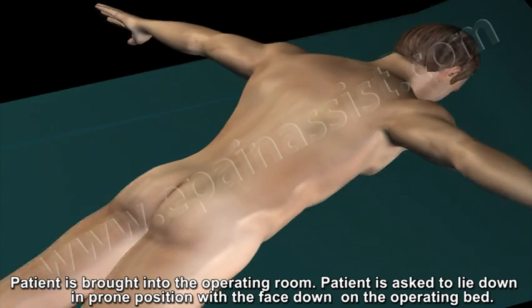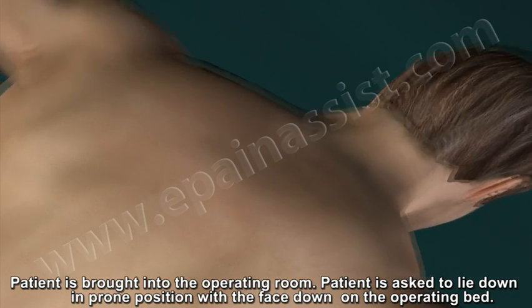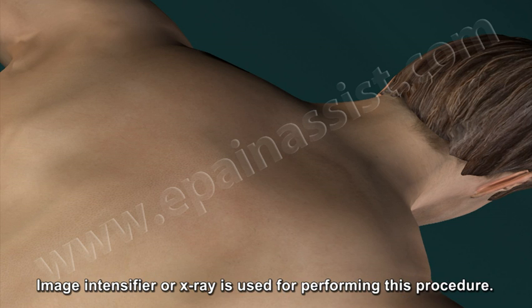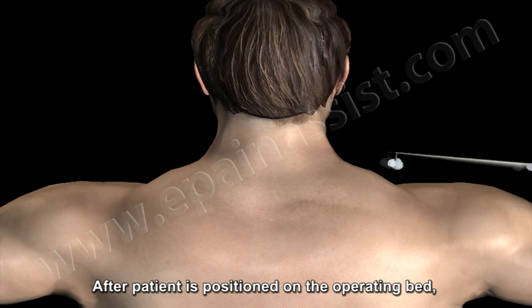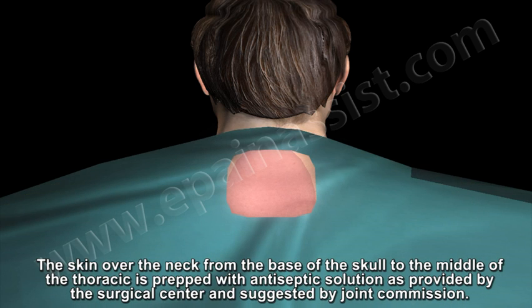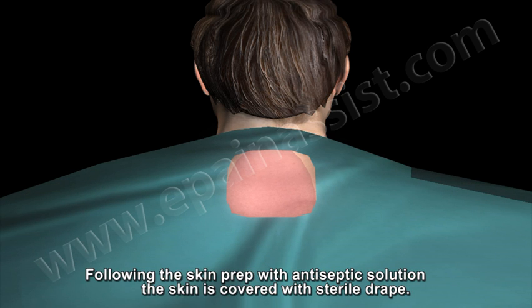Patient is brought into the operating room. Patient is asked to lie in prone position with the face down on the operating bed. Image intensifier or X-ray is used for performing this procedure. After the patient is positioned on the operating bed, the skin over the neck from the base of the skull to the middle of the thorax is prepped with antiseptic solution as provided by the surgical center and suggested by the Joint Commission. Following the skin prep with antiseptic solution, the skin is covered with sterile drape.